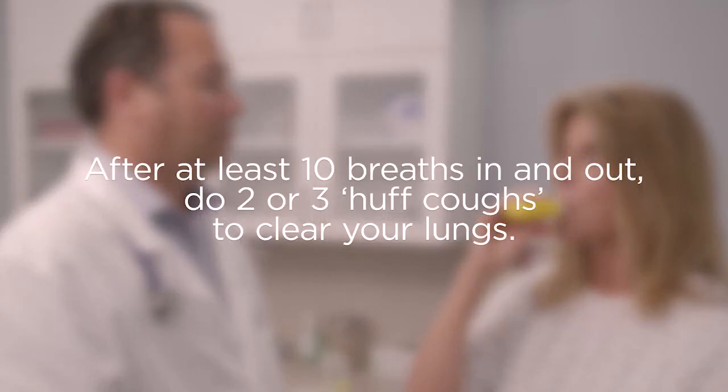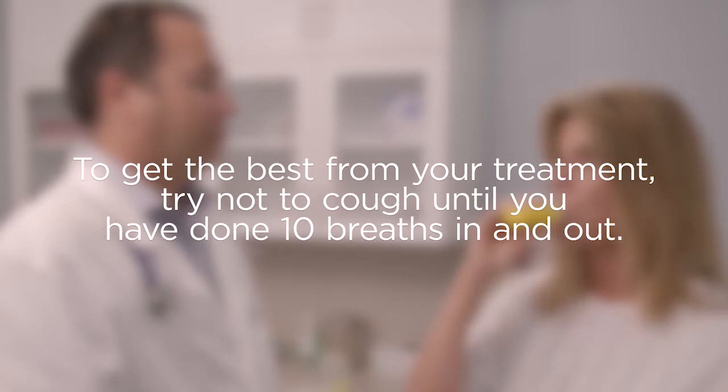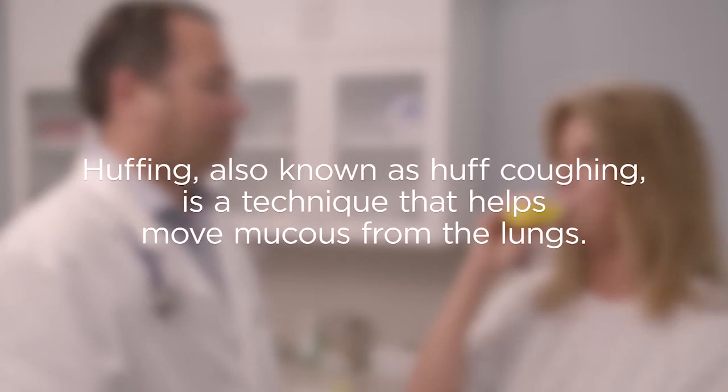After at least 10 breaths in and out, do two or three huff coughs to clear your lungs. To get the best from your treatment, try not to cough until you have done 10 breaths in and out. Huffing, also known as huff coughing, is a technique that helps move mucus from the lungs.